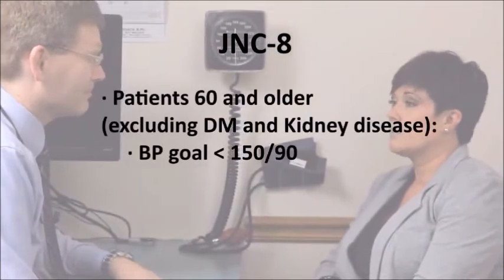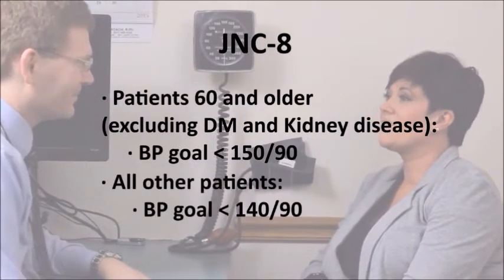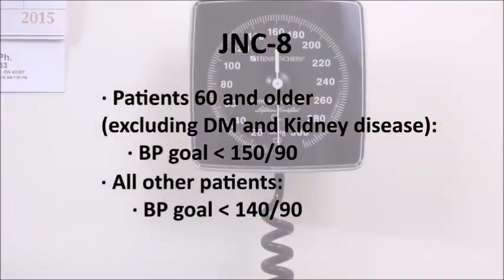In the outpatient setting, blood pressure is measured indirectly. It is important to use proper techniques so that readings are consistent and reliable. According to JNC8, patients 60 and older who do not have diabetes or kidney disease need to have blood pressure under 150 over 90. For all other patients, the blood pressure goal is less than 140 over 90.